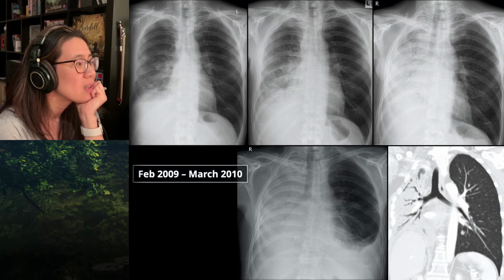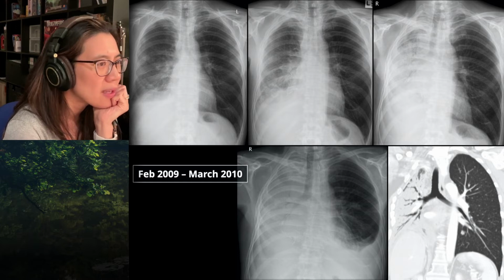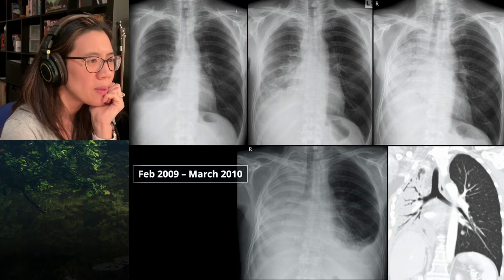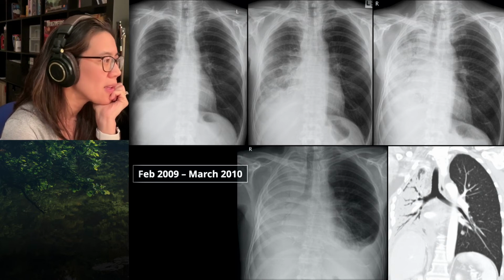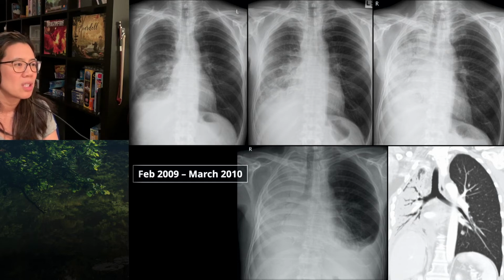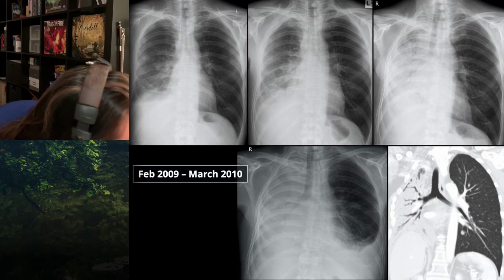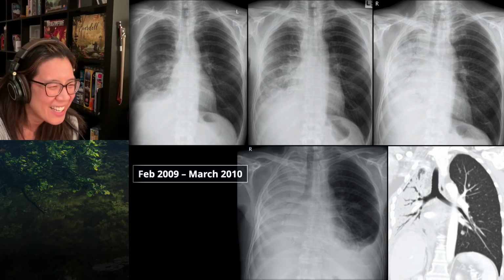Right. Then what have they done? They've resected it, and then over the course of the X-rays, has he had radiotherapy? He's had whole lung radiotherapy, effectively whole pleural radiotherapy. Right. So the lungs just got smaller and smaller and smaller. Yep. So this is another cause of a small white lung is fibrosis. Wow. So the airways are all patent, but the alveoli don't contain any air. Yeah. So as a CT shows, he's got air bronchograms going all the way out to the chest wall just about. So I was right to be confused. All right. So another cause of a small white lung.